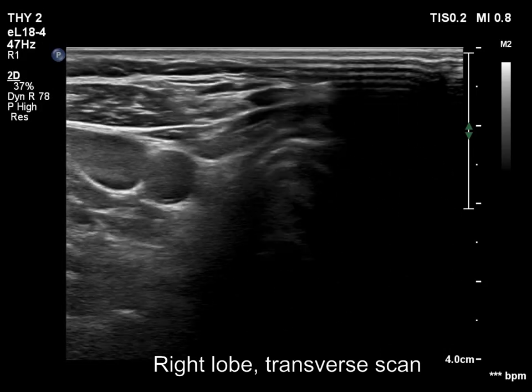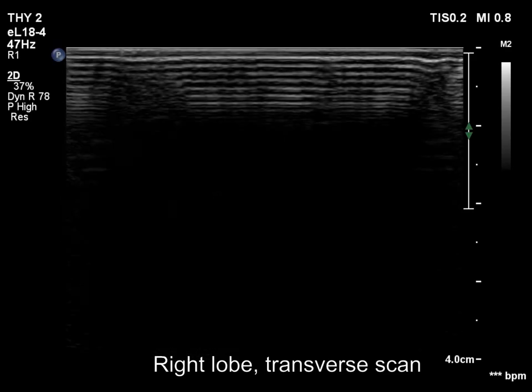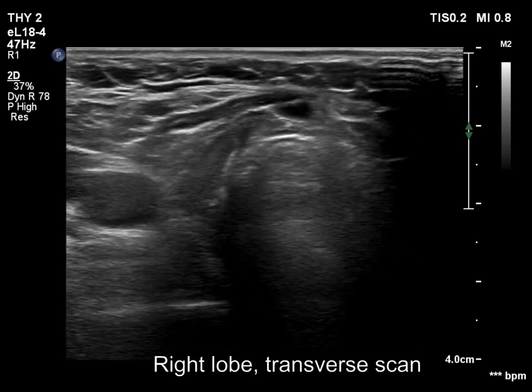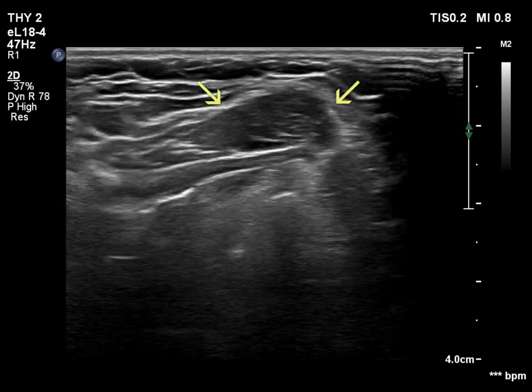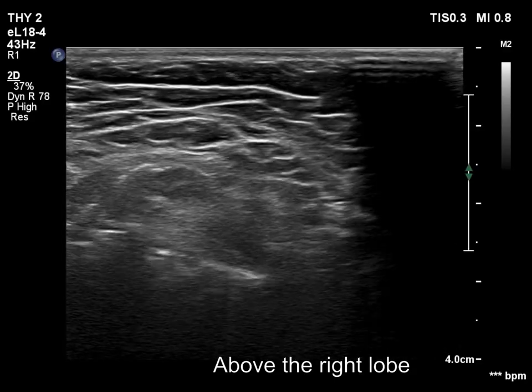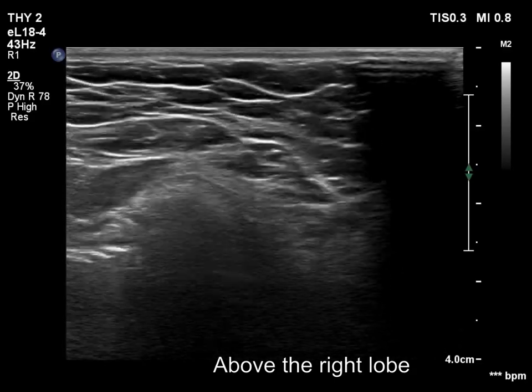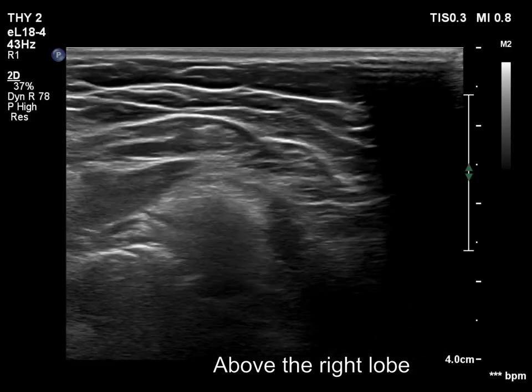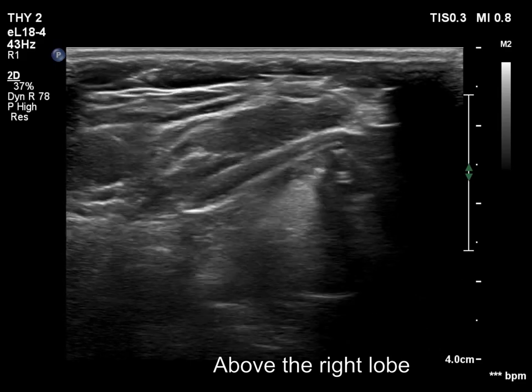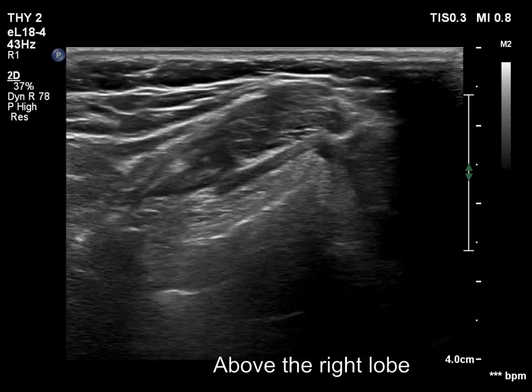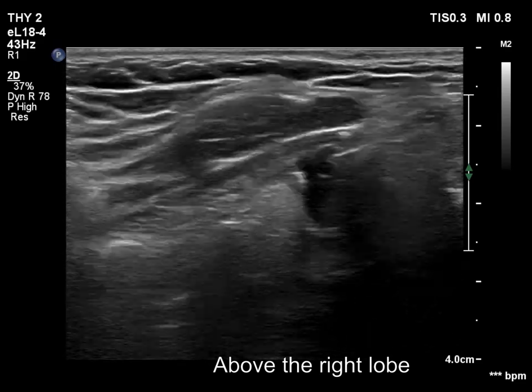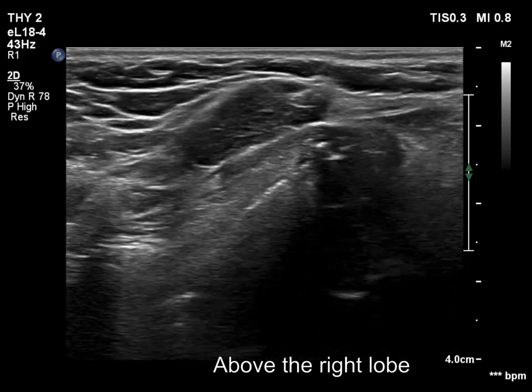There is no thyroid tissue in the right thyroid bed. There is a hypoechoic mass several centimeters above the usual location of the thyroid. The echogenicity of the mass is very close to the neighboring muscle fibers; nevertheless, the ectopic tissue is less hypoechoic.